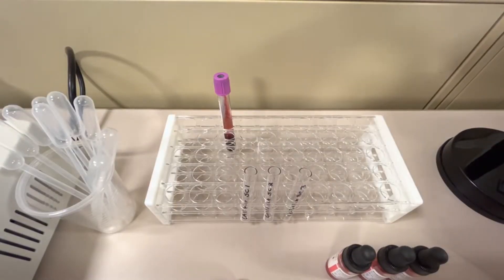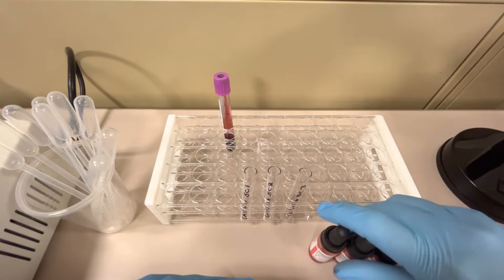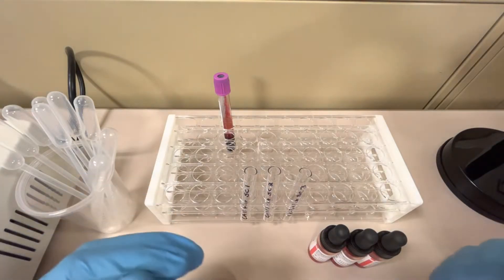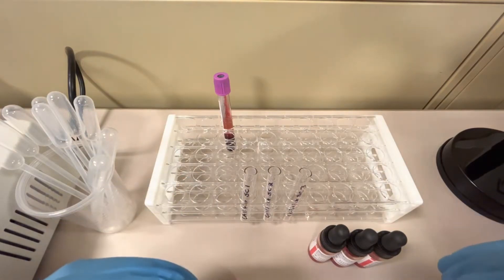Today I'm going to show you how to perform an antibody screen. This is a procedure we do in blood bank all the time — it is part of the type and screen. A type involves doing the patient's ABO blood type, and the screen is what we're doing today. This detects whether or not the patient has any alloantibodies in their plasma or serum — antibodies present from either an exposure through pregnancy or from a blood transfusion.